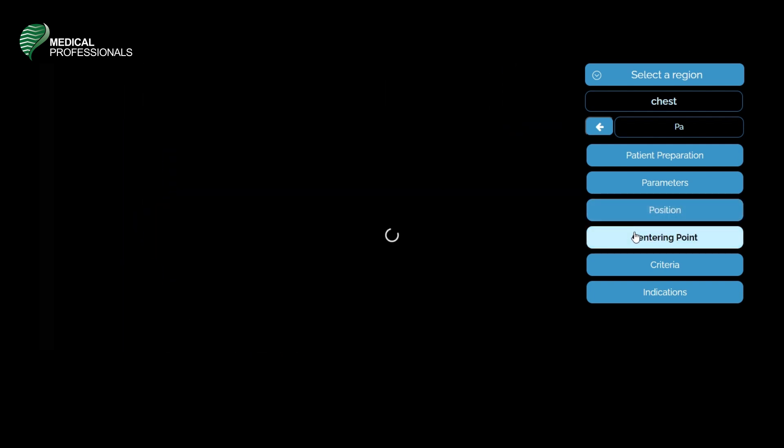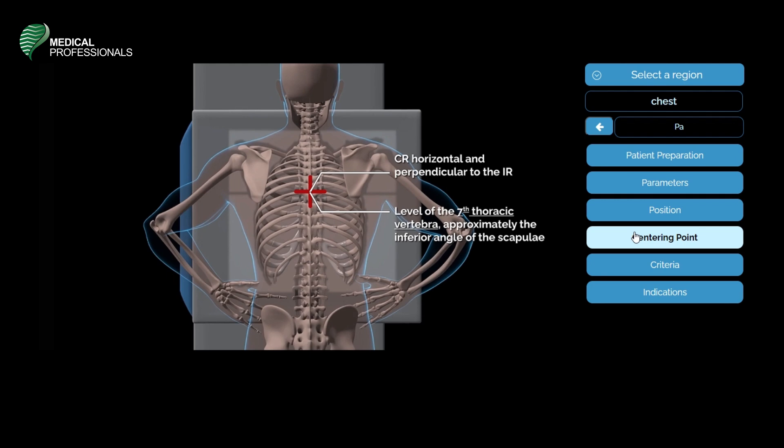The central ray will be horizontal and perpendicular to the image receptor. It will be at the level of the 7th thoracic vertebra, approximately the inferior angle of the scapulae.